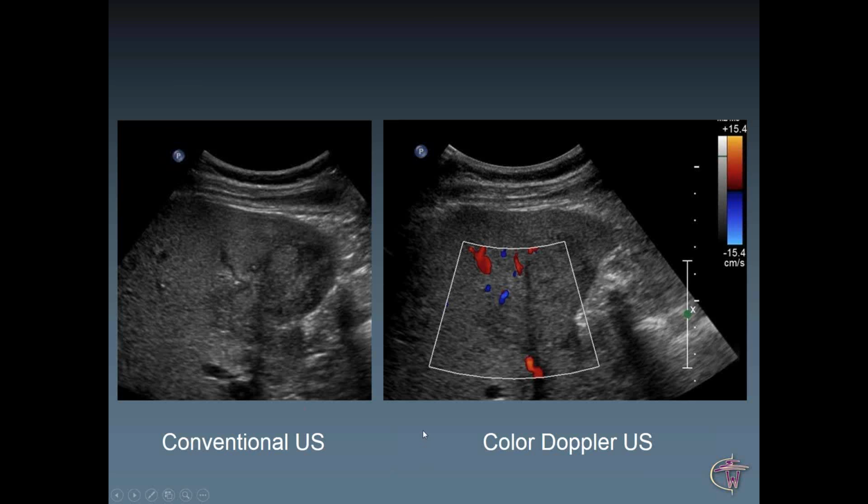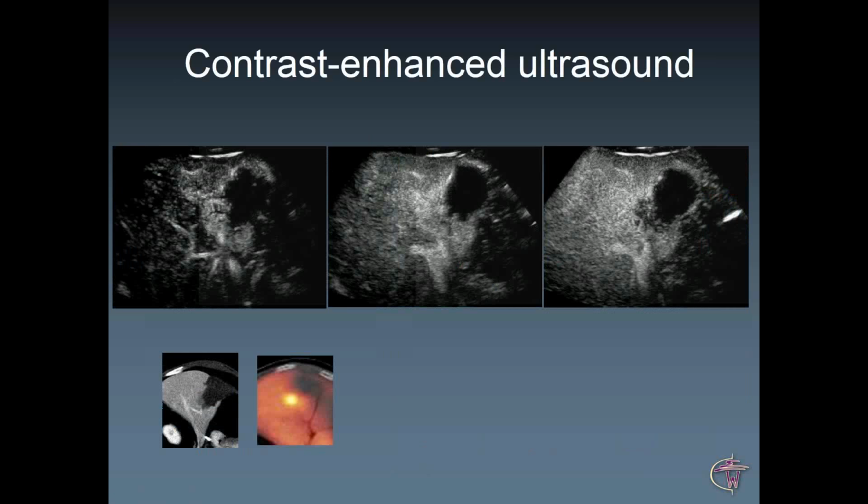So what you do then is you can either do the navigation technique, or you can use something more simple, and that is ultrasound contrast, which is the new kid on the block for the US since last year. It's helpful in some cases. So you can see the ablation zone here, not enhancing at all. You see a hypervascular nodule which rapidly washes out, just after 30, 40 seconds. You see the washout here, and that correlates pretty nicely with this portion on CT and PET.